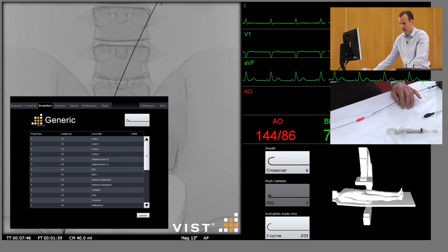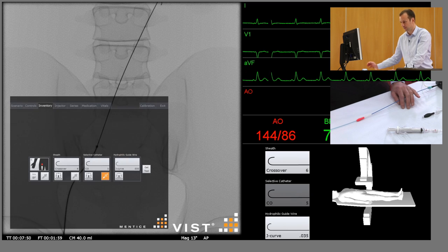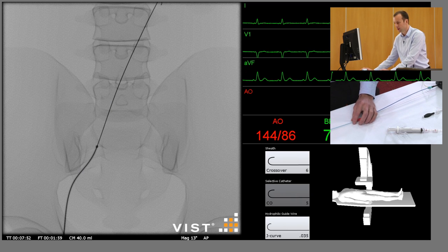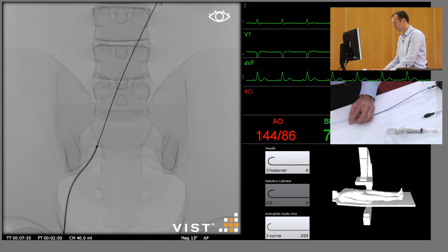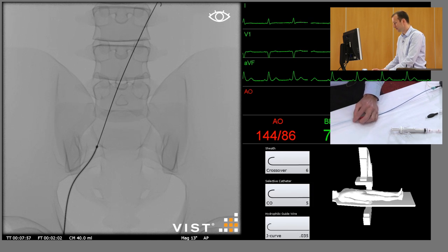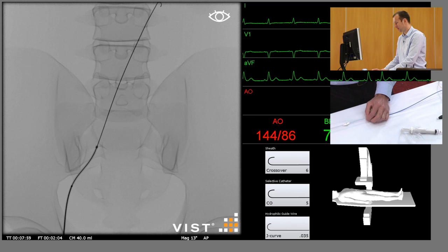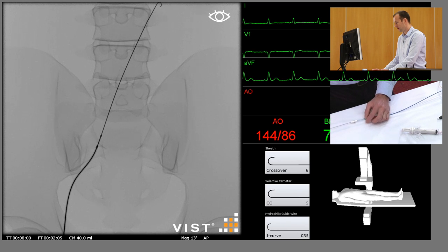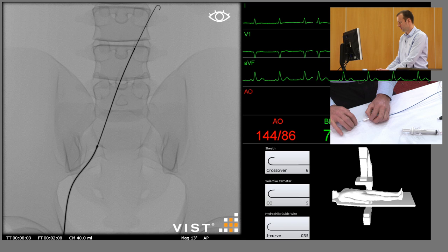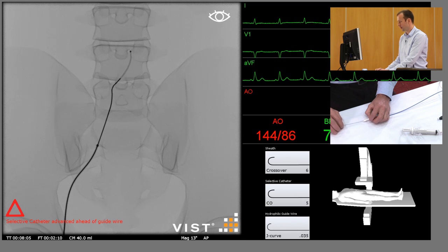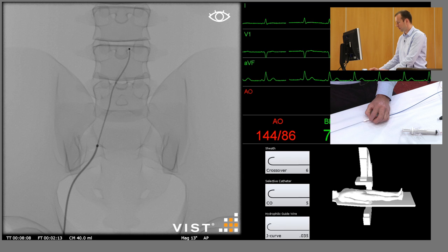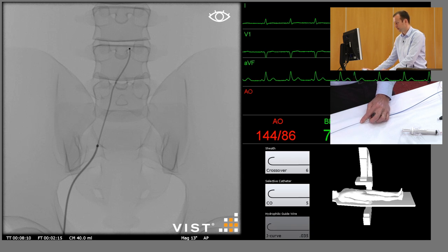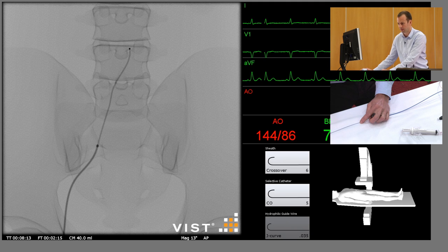So we're going to use a five french crossover catheter. We're going to insert this over the j-tip wire above the bifurcation. At this stage we're going to remove the j-tip wire and replace it with something that will let us better cross the lesion and cross the aortic bifurcation.